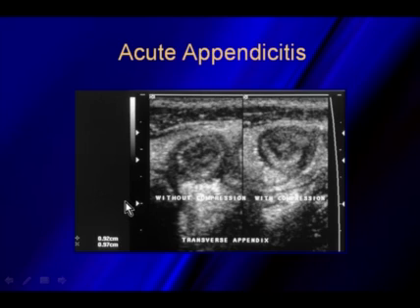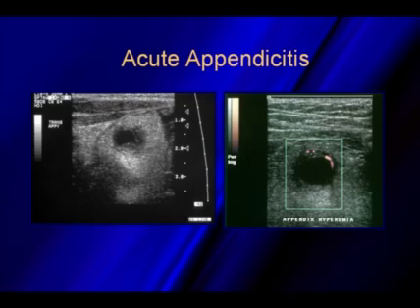Looking at a short axis view with and without compression, you can see that we do not have any compression of the appendix, but I think it would be quite obvious that in a case like this you will not get any compression.